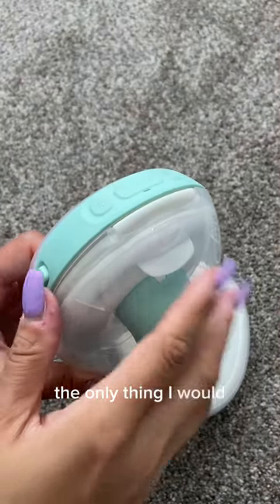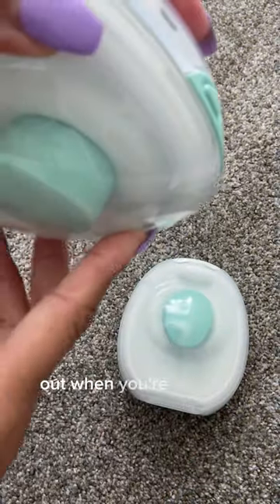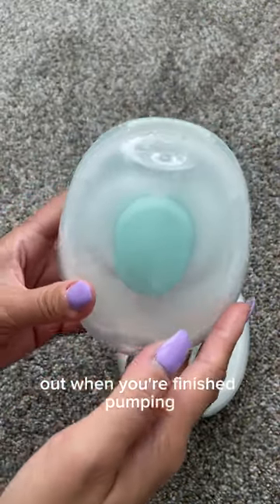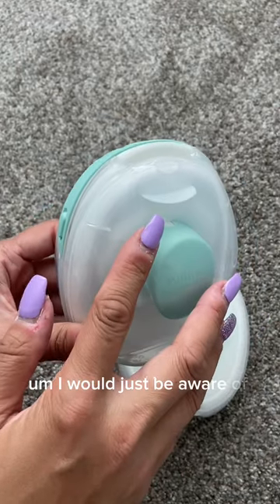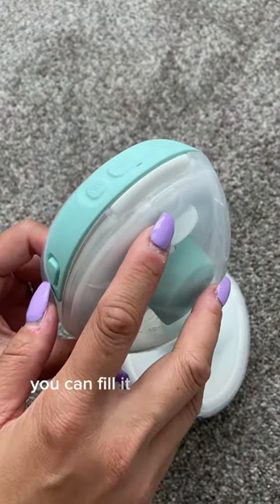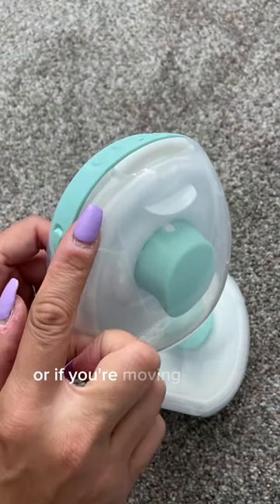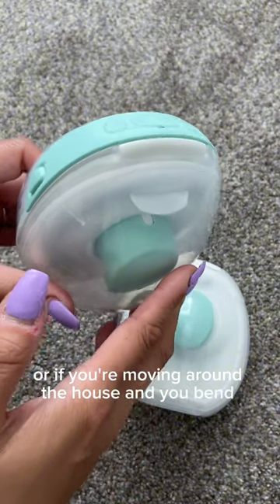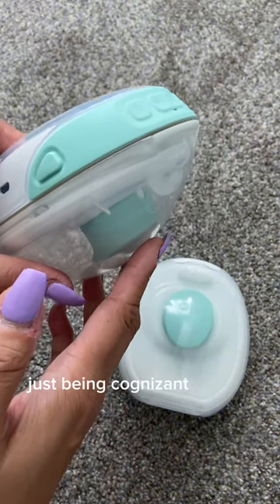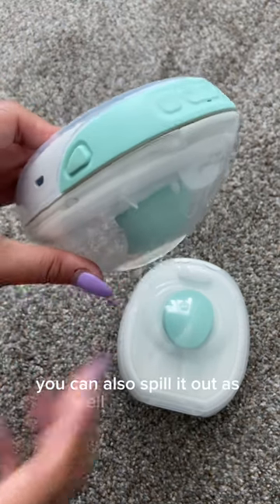The only thing I would say is that there is a hole up here — this is where you would pour the milk out when you're finished pumping. Just be aware that if you are an overproducer, you can fill it really close to the top and it will spill out. Or if you're moving around the house and you bend over, just be cognizant of how far you're bending over, because you can also spill it out from the top.